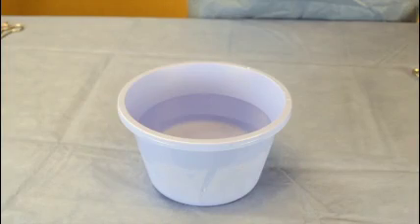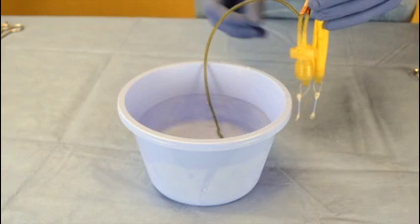Partially fill a graduate or basin with sterile normal saline. Make sure to keep the solution free of any contaminants like blood or antibiotics. Submerge the black tubing from the pump into the saline, being careful not to introduce debris or blood into the saline that could plug the pump valves.